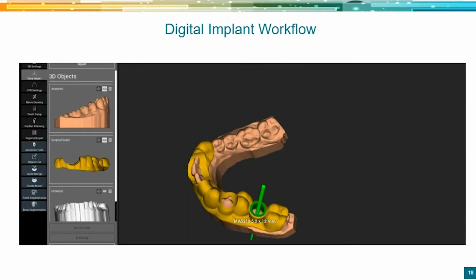And then when you're all said and done, here's the example. My final has 2 little windows there that help confirm seating. I can export that quite simply and send it off into a 3D printer. I can email it to my lab, has a 3D printer, and so on, and get myself an actual physical model of it. Okay, so a really quick 10 times example here of me using that software. It's about a minute-long video just so we can see, and this will pop up here in a second.